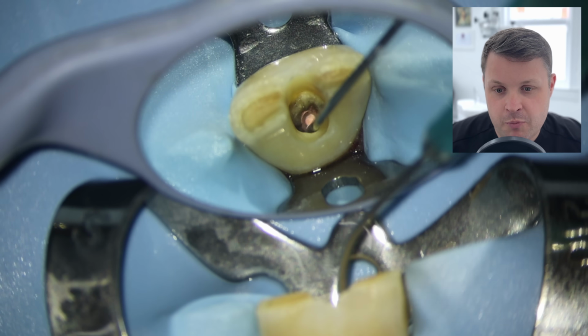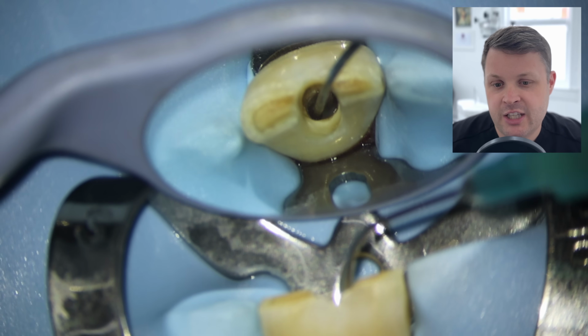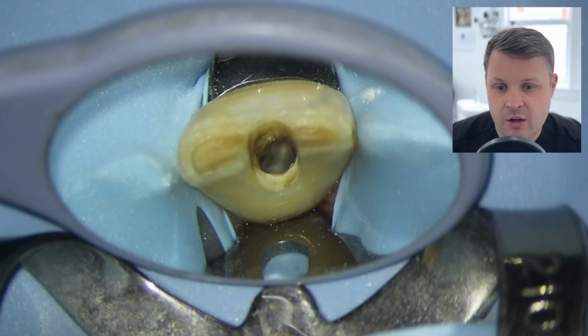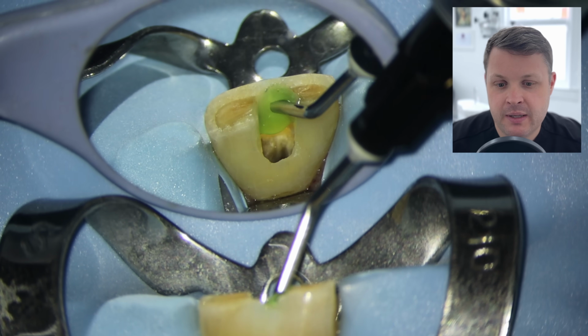I'm going to use this Vitribond. This is a GIC which is light cure, and I'm going to use these Akidos tips so I can place the GIC exactly where I want it. And we can see now that we've got GIC over the perforation repair.